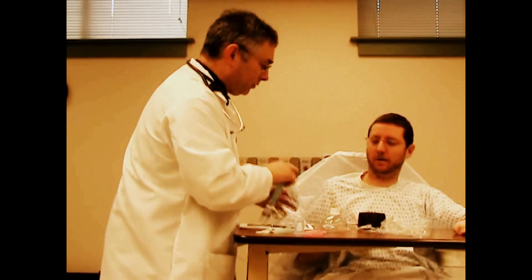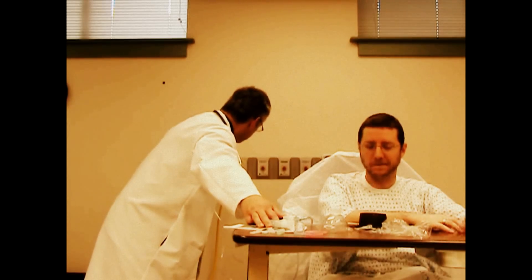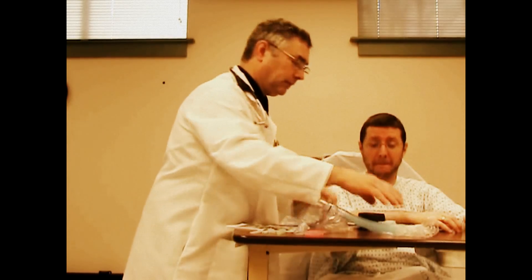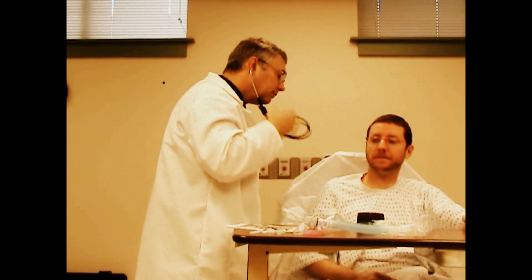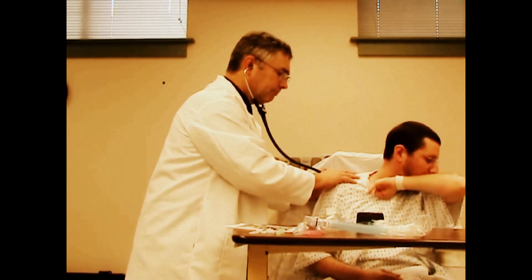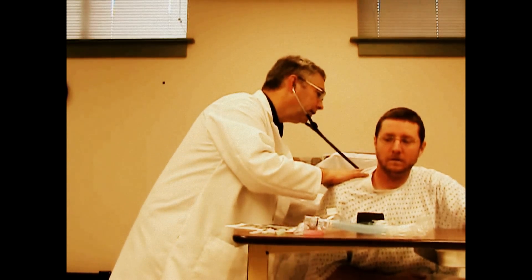Ten minutes have gone by. The treatment's done. Now let me turn this all off. I'm going to take your pulse. I'm going to take a quick listen to your lungs. How does that feel? Like you have something to cough out? It feels a little loose. That's good. I was able to swallow a little bit.